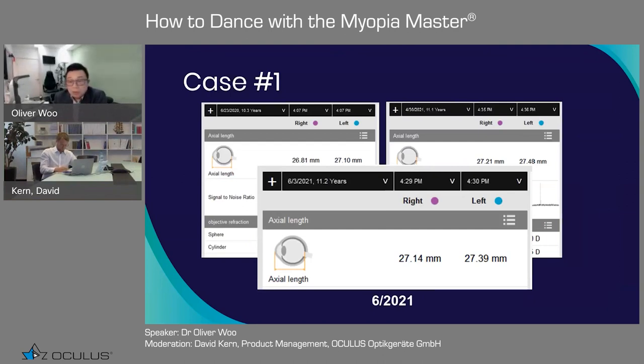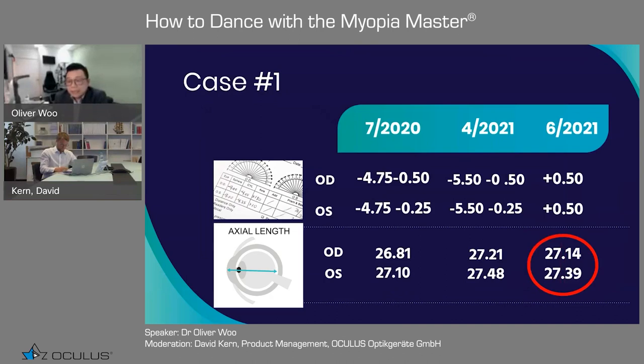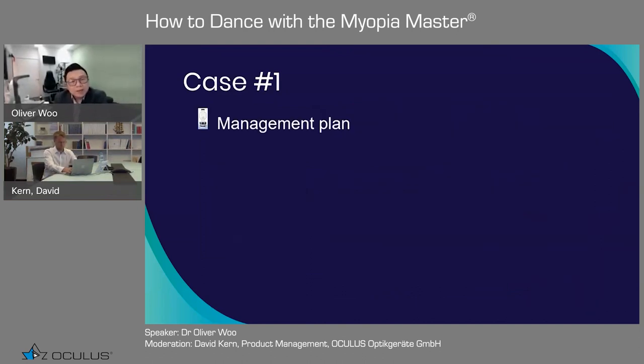So he came back not long ago, and we can see the axial length shortening, and also the prescription of orthokeratology is plus 0.50. So he's really happy. And something we have to think about for this case study is, what is the management plan we need to do?